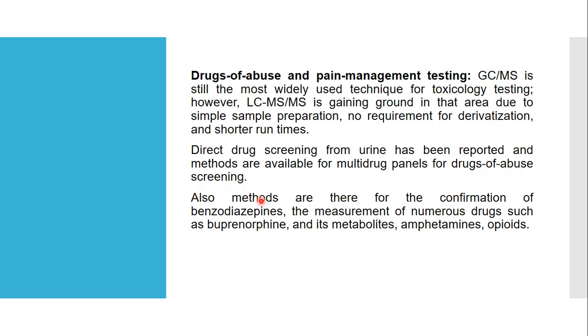Also, methods are there for confirmation of benzodiazepines, then measurement of drugs like buprenorphine and its metabolites, amphetamines, opioids. So you can see these are the habit forming drugs which are often abused. So its analysis can be done by LC-MS/MS. Therefore, LC-MS/MS finds application in drug of abuse and pain management testing.